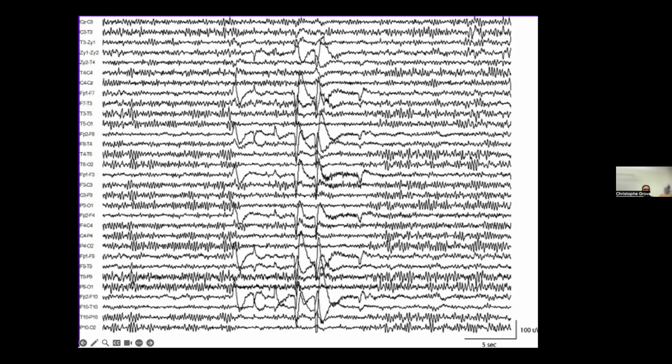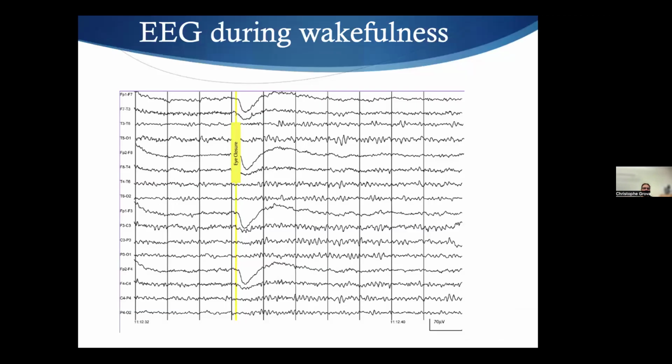Relax. It's not always the case. Some people are more stressed, and some are not generating that much alpha. Some are generating alpha even with eyes open, but that's the basic idea. Recording a good alpha with eyes closed is a good sign that you have a decent EEG. And so this is just another example.